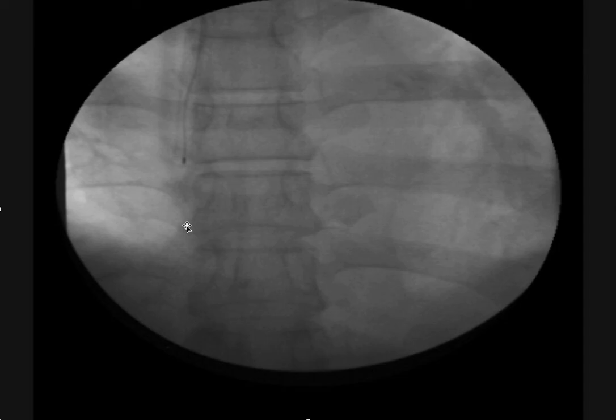And then also starting with the curved femoral sheath, the 16-French curved femoral workstation, rather than the straight femoral workstation, because that way you can direct the snare where you want it to go without using the curved inner sheath. Because if you use the curved inner sheath to direct it, you tend to push it forward, and then you can never nail it because the threader loop always goes to the wrong spot.